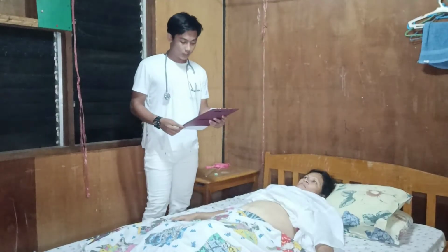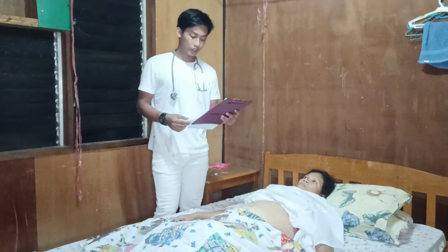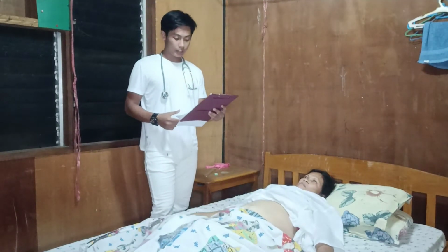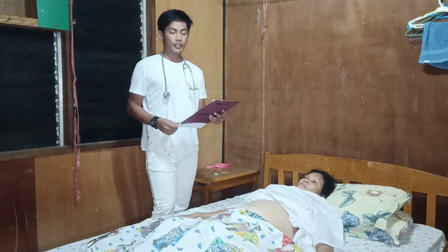Now for the vascular sounds, use the bell of the stethoscope to listen for bruit over the abdominal aorta and renal, iliac, and femoral arteries, venous hum in the epigastric and umbilical areas.